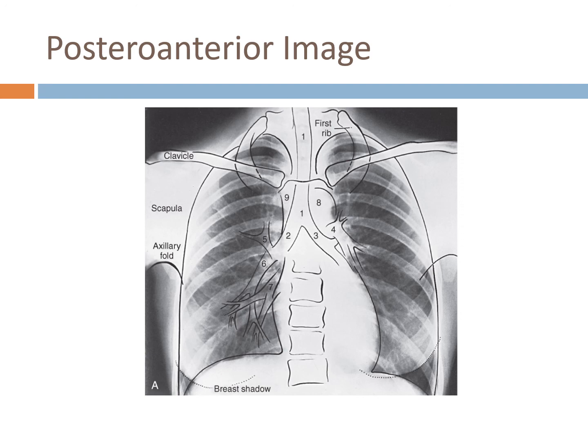6 is, I'm sorry, that's 6, your right interlobar artery. Your right upper lobe pulmonary artery is 5. And then your right lower and middle lobe vein being 7. Now, you're not expected to really know these on films. You can see it's just vasculature, okay? You can see the blood vessels is what all that haziness is. You should be able to identify the carina, the clavicles, whether you're in a main stem bronchus with intubation. But it is kind of cool to know where all these things are.